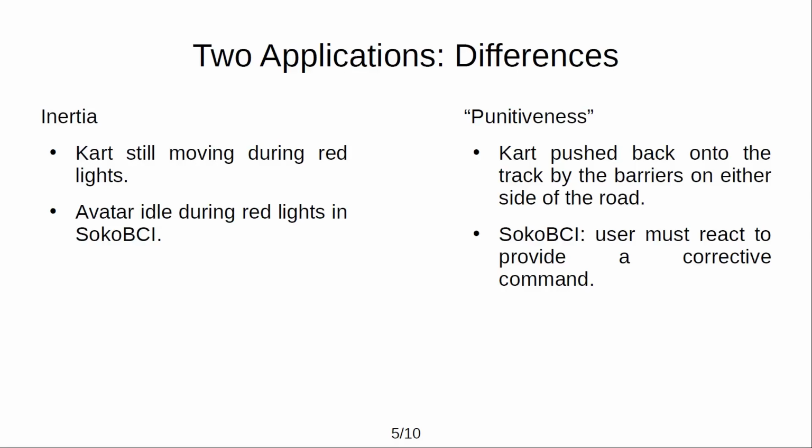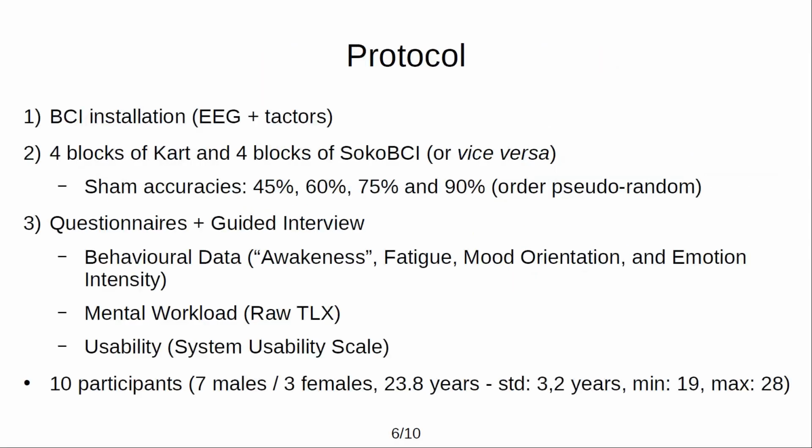Now let's describe our protocol. First, we install the BCI on the subject, so the EEG cap and the tactors which provide the stimulations.